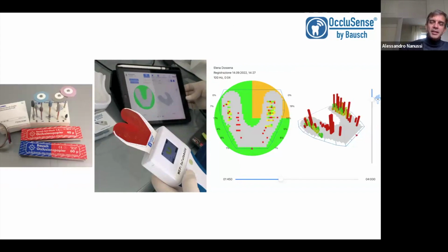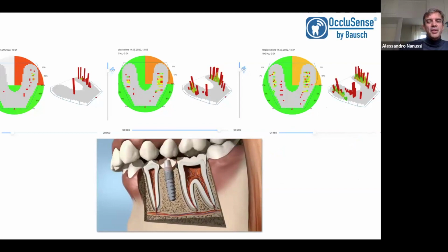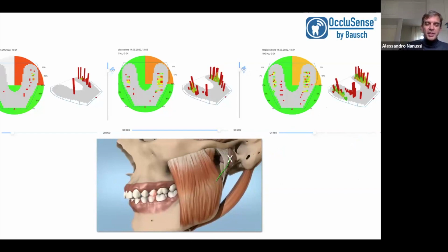And then, well, what about the OccluSense analysis? You can see it's easy to see that the precocity of contact on the first premolar that I suspected with the card is absolutely confirmed and shown by the analysis with OccluSense. You can see the red spike really evident on this tooth. And this precocity could be not so important, but it is important, because I don't want to damage the patient. I don't want the patient to change his movement to avoid contact, or not change his movement and load the restoration and crack, damage, and the next instances of my restoration.